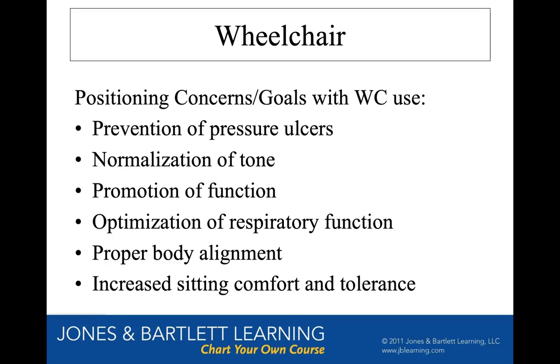If I sat in my chair right now, where I'm sitting for this whole lecture, my ischial tuberosities and my coccyx would be so sore, and probably have like stage 1 pressure ulcers. So we're always moving around. Well, most people in wheelchairs can't do that. So they have to have certain specialized cushions to help them prevent pressure sores if they can't do pressure reliefs.